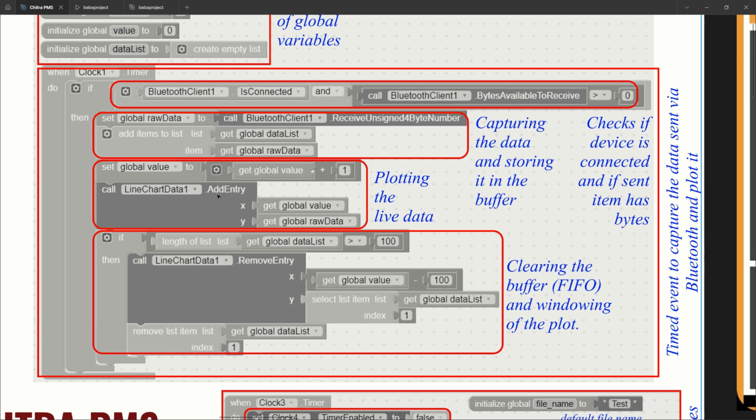Okay. Now we cannot have an infinite number of timestamps or data points visible in the graph. So what we do is for every 5 seconds we show that, and then we move the window. Once the window is moved, it will show the past 5 seconds of data. For example, I'm looking at this plot at this particular instant. It will show me that particular instant and up to 5 seconds back. Okay, it is called the windowing thing, and we have implemented it, as I told, with 5 seconds of data, updated every 50 milliseconds.